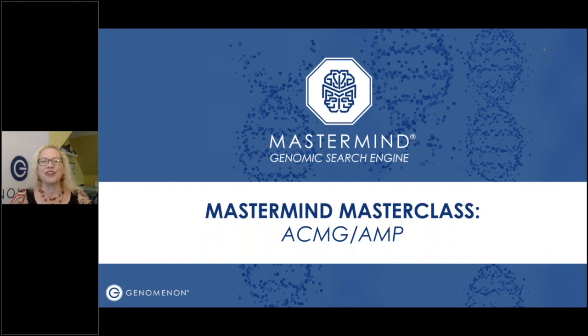This masterclass will focus on one of the most popular features of the Mastermind Genomic Search Engine, which is the ability to filter by ACMG AMP criteria. Filtering by ACMG AMP criteria is a professional feature, so if you currently have the basic edition, some of this may not look familiar to you. During the demonstration, you'll see many other features that you may not be aware of are available in Mastermind, and I have great news that I can show you in a minute.